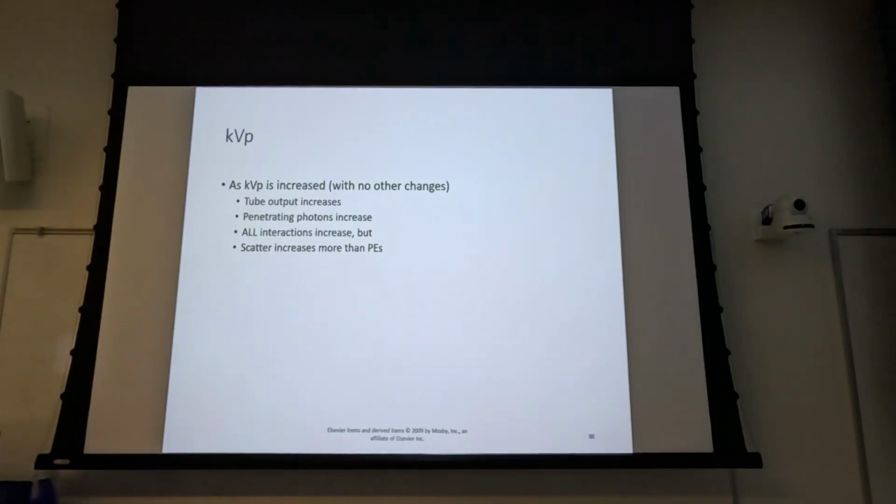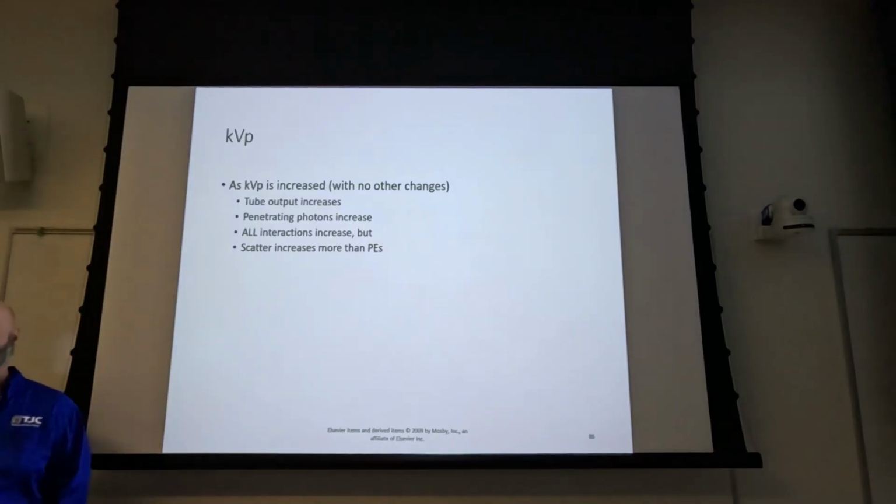Right? So can you give us an example of how you would word a question like that? Yeah. Okay, and that's a great question. Make sure you understand the question first. So if I ask you a question that just says, as we increase KVP, what happens to scatter radiation? Your answer choices may be, as KVP increases, we get an increase in Compton. Okay, so that's true. Approaching this from 3 different directions, that will be your answer. You get an increase in Compton.